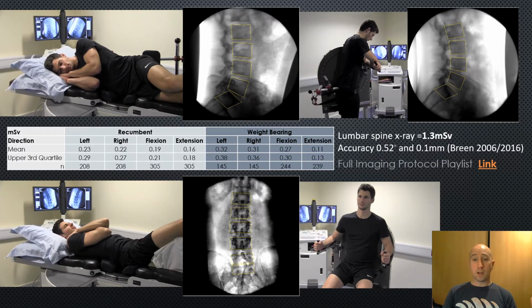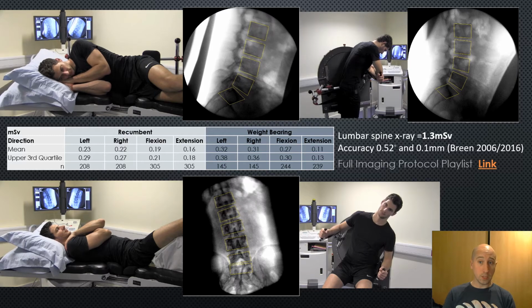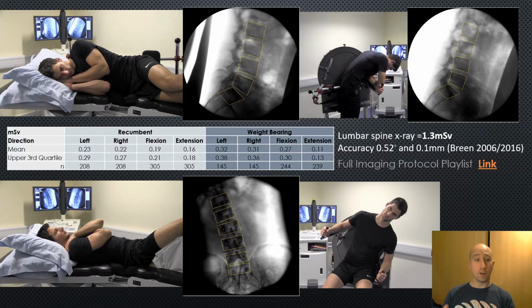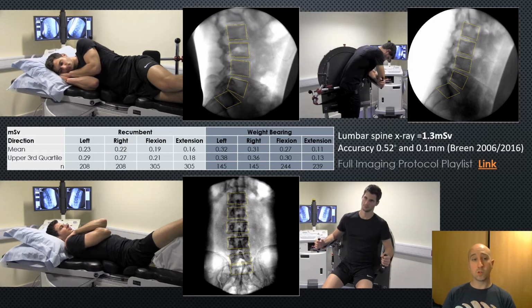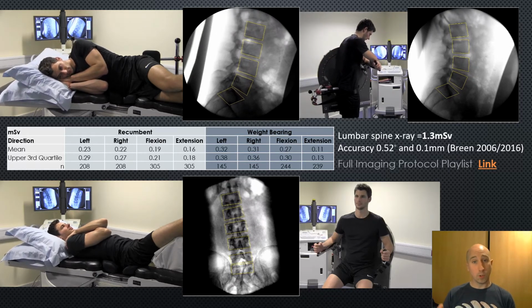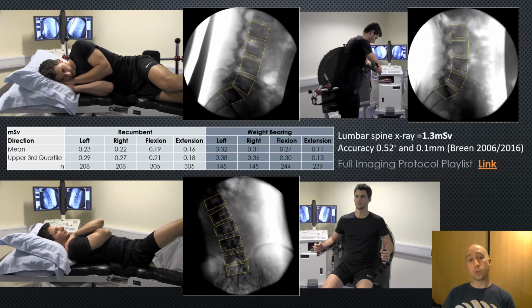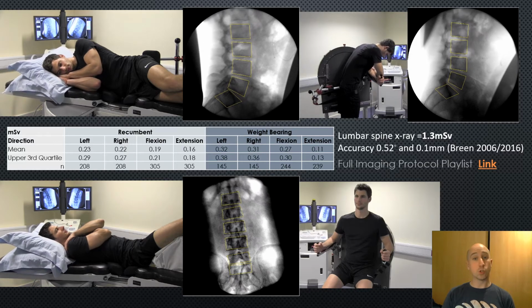So these are some of our quantitative fluoroscopy protocols in action. You see here the controlled motion of our participants. I've not put the fluoroscope in these videos so you can see the motion of the participants, but usually a fluoroscope would be a C-arm which will go around the participants, having the intensifier as close to the participant as possible to remove any image distortions.